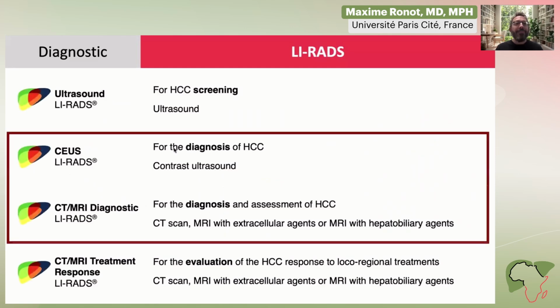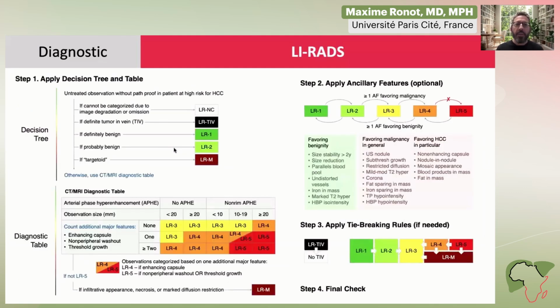Now, to be fair, we have different LIRAD systems. Today we are going to talk about the diagnostic LIRAD system, especially for CT and MRI, and I'm not going to discuss everything with you. I'm not going to go into details. You know, it's a multi-step process.